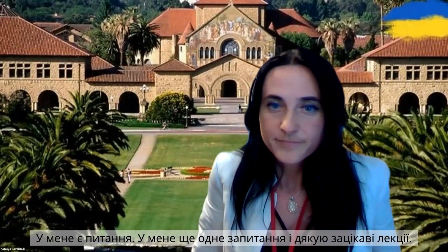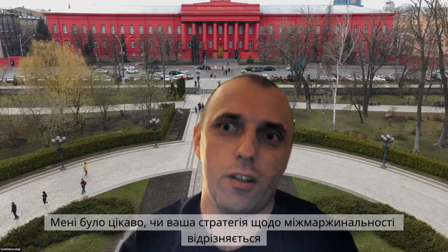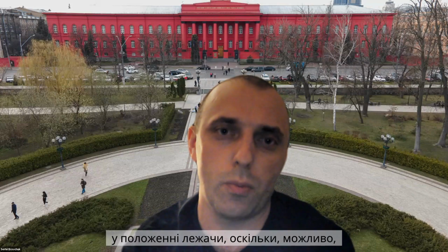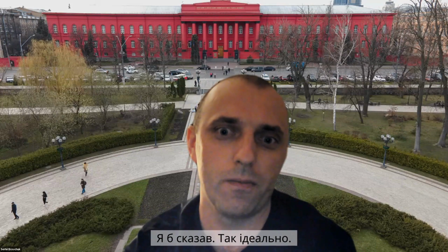Okay. Thank you. Sergey, you have a question? I have one more question. Thank you very much for very interesting lectures. I was wondering if your strategy in terms of PTV margins is different in prone position versus supine position, since maybe the prone position is more unstable, I would say.